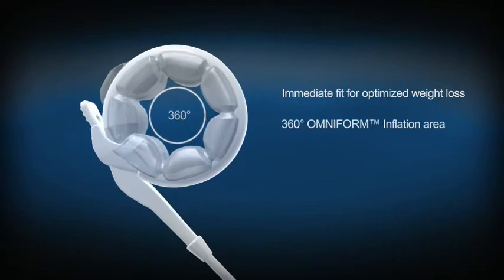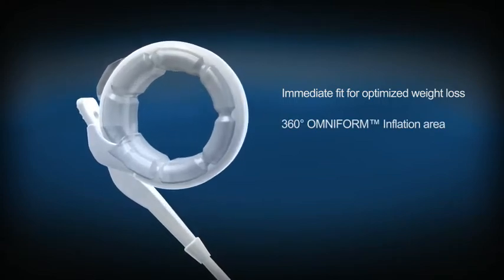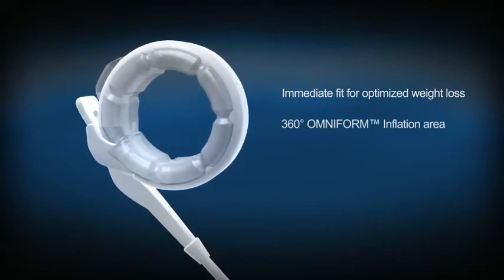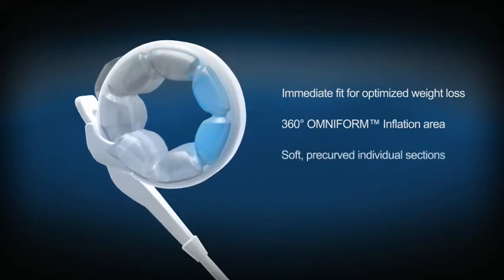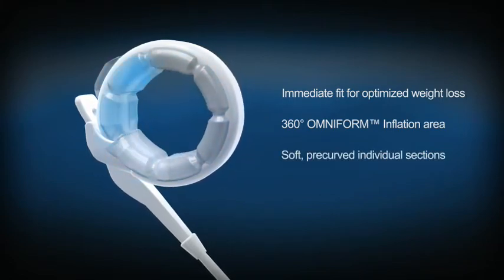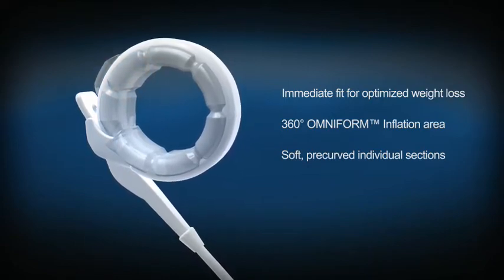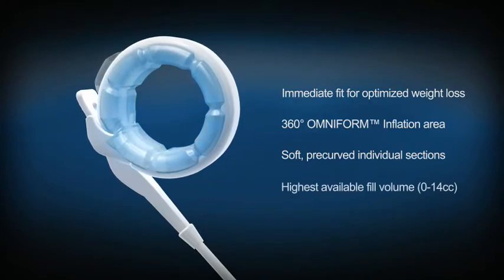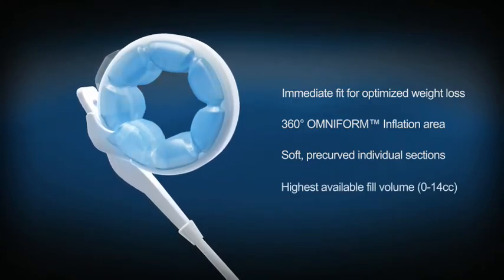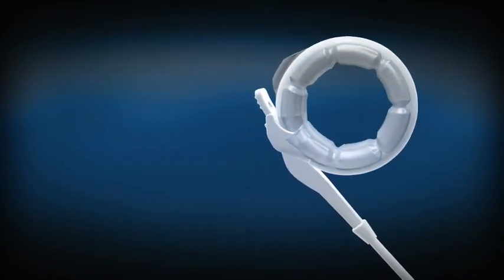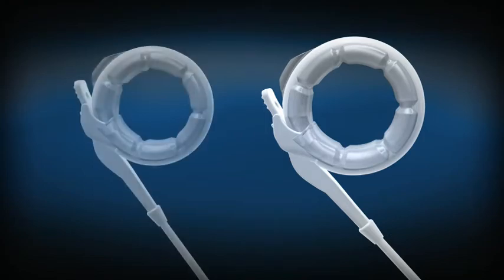Omniform inflation provides 360 degrees of pressure evenly delivered throughout the band for complete stomach coverage. Soft and flexible pre-curved individual sections help minimize the potential for leaks from creases or folds. The highest fill volume available leads to greater flexibility and customized adjustments. Available in two sizes to accommodate different anatomy and individual needs.